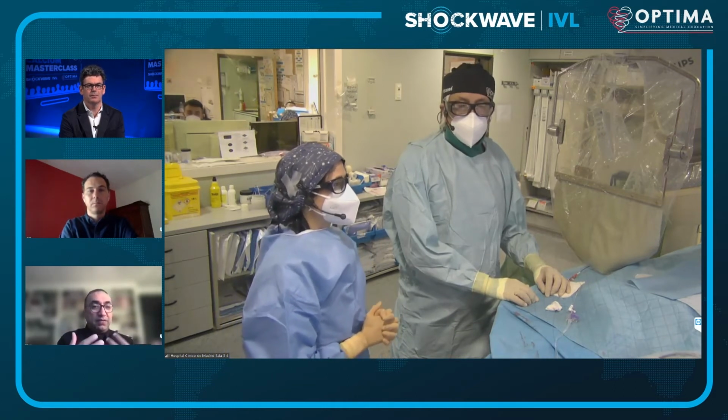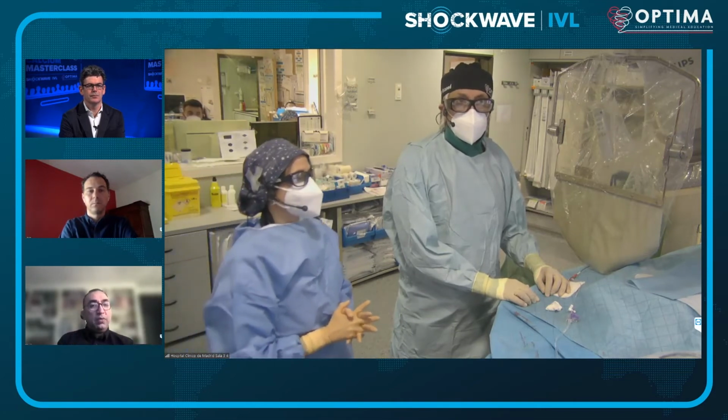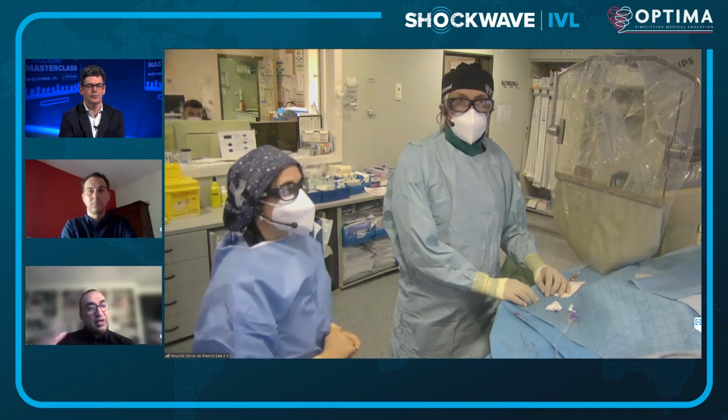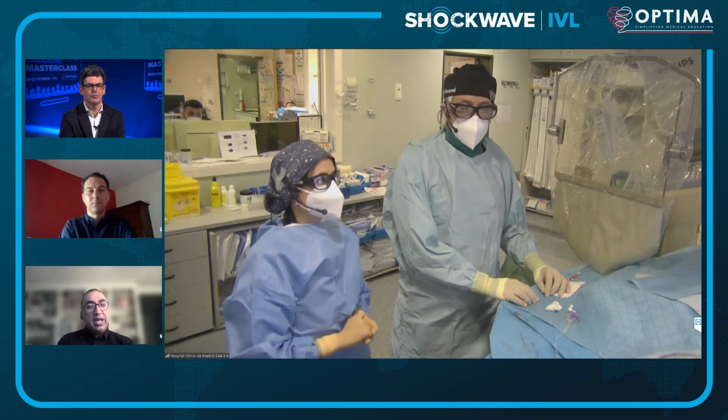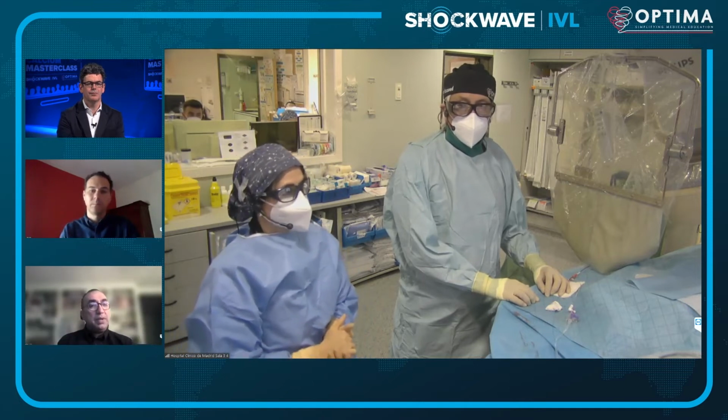It's a severely calcified lesion, and I don't think it's beyond the realm to say that sometimes we use the atherectomy to cross the lesion and create some space, and then we use the lithotripsy because it's such a large vessel to really impact the calcium.